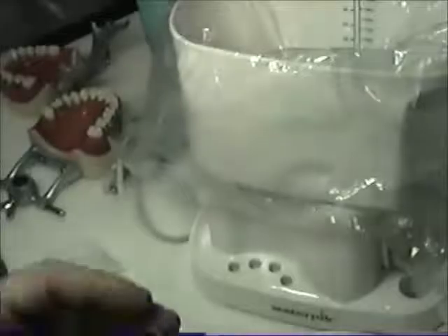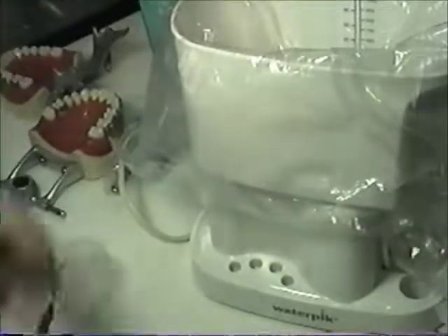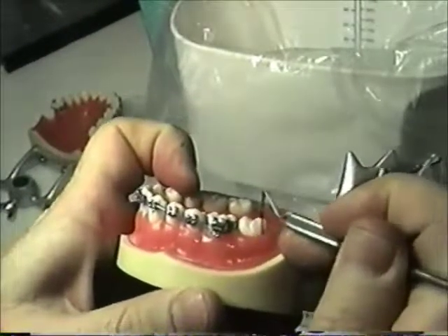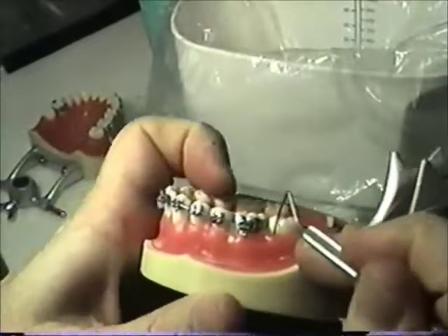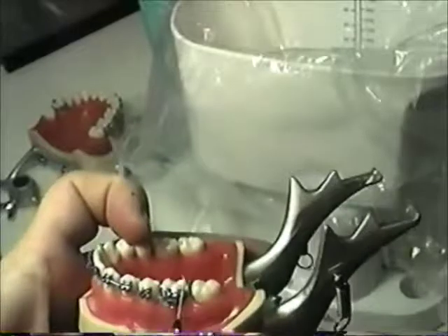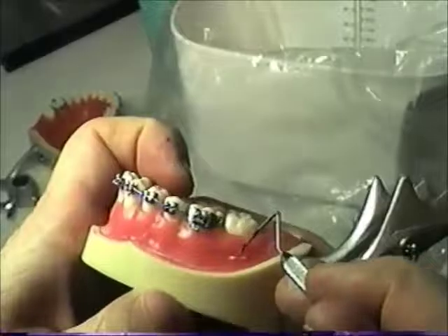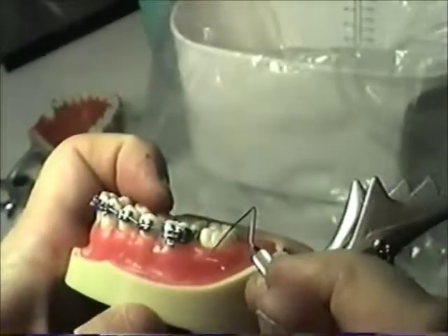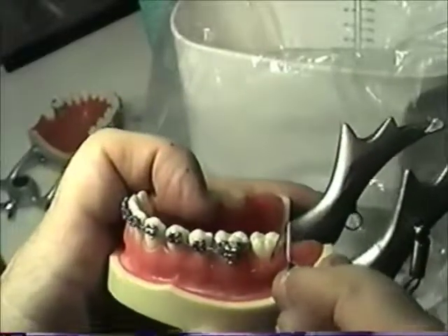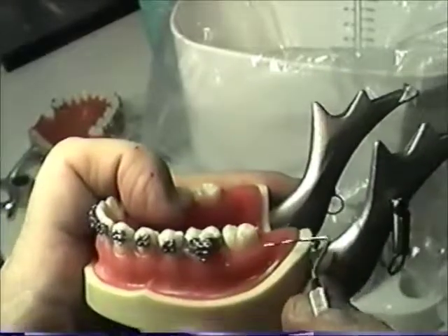Because if you probe up under the gums on somebody that's healthy, like me, and this model here, no blood comes out. But if you probe down here and blood starts rushing up, that means the bacteria down there are eating away this healthy gum on the other side of where this probe is. So this gum here is just like this, and then it comes over and folds over just like my thumbnail. And that gum, if you were to pull it back, just like I'm pulling it back right now, look down in there, it should be all nice and healthy like this.